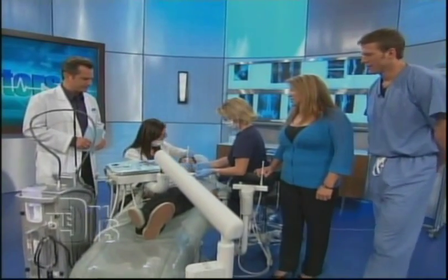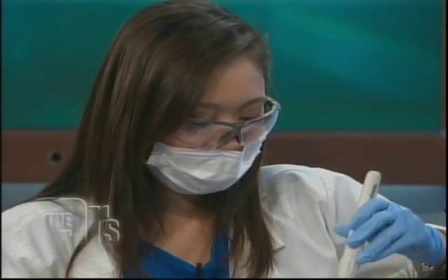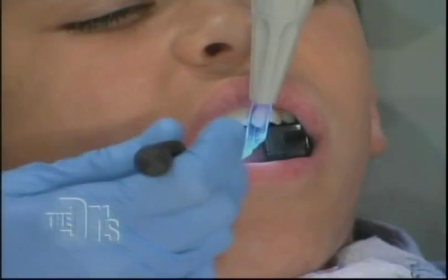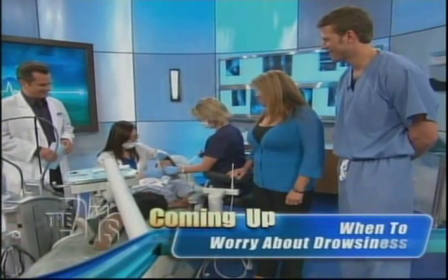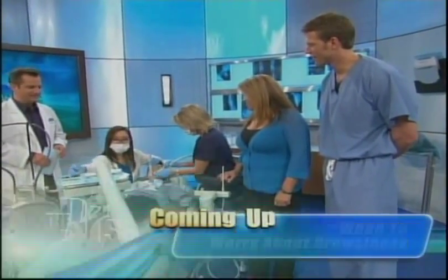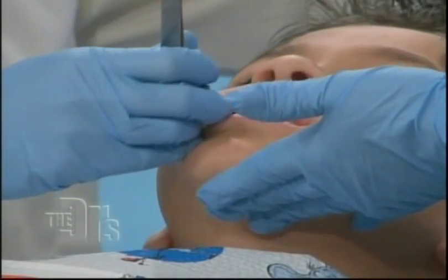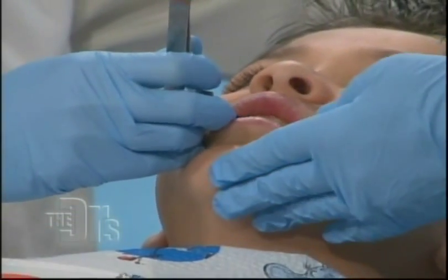Are most dentists' offices going to have this Waterlase, or is it still pretty new? A dentist has to be well-trained in order to use it — we want to be on the cutting edge of technology. Is there any solution for the sore jaw from having your mouth open so long? That's why we're using a tooth pillow — it cushions how long you're open. But with the laser filling, it's really quick. We're going to have Zach bite on this blue paper to make sure we've built it up perfectly.